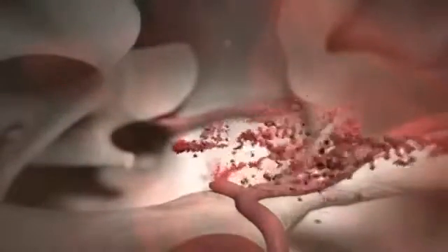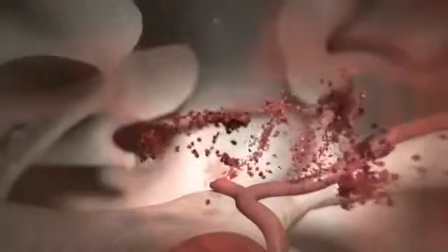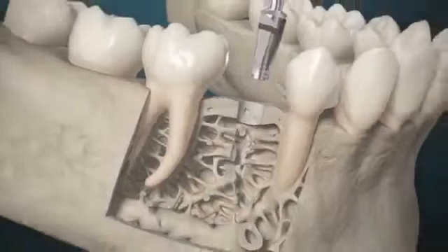Sometimes, however, the unexpected happens. A drill intrudes and destroys the naturally sculpted bone. Blood vessels are torn and a major defect is created, quickly filling with blood. The titanium implant is inserted where the tooth was previously lost.